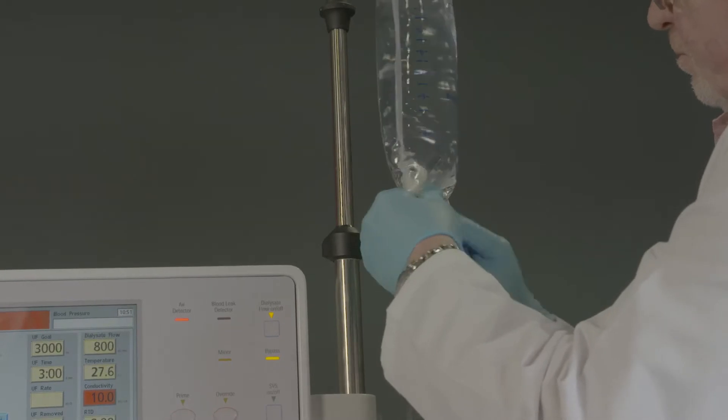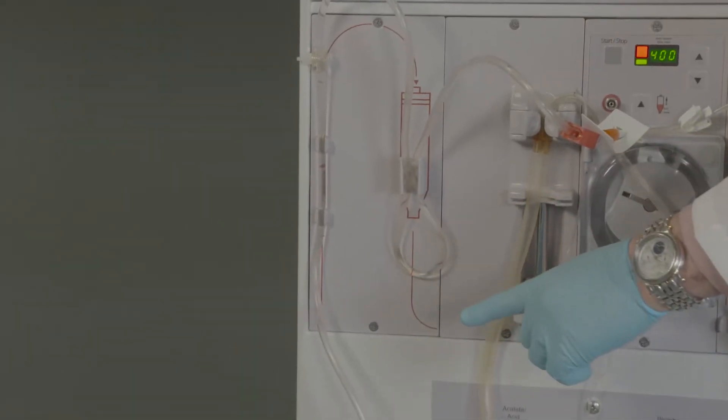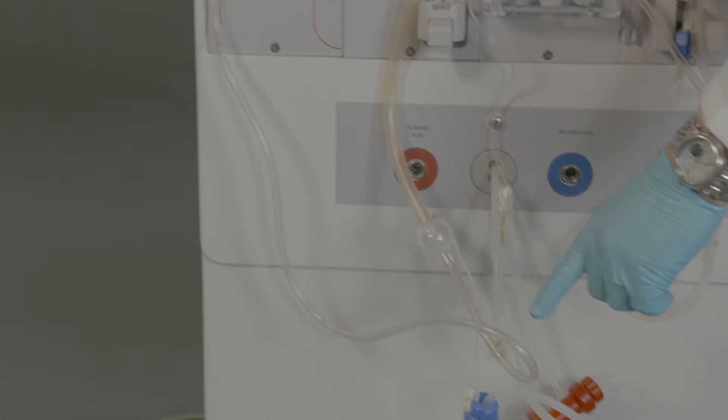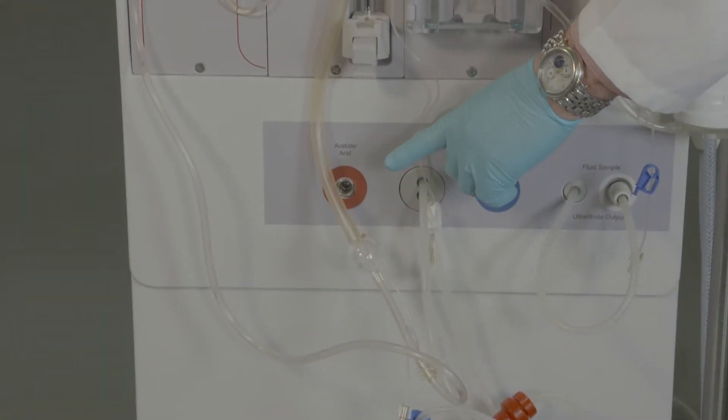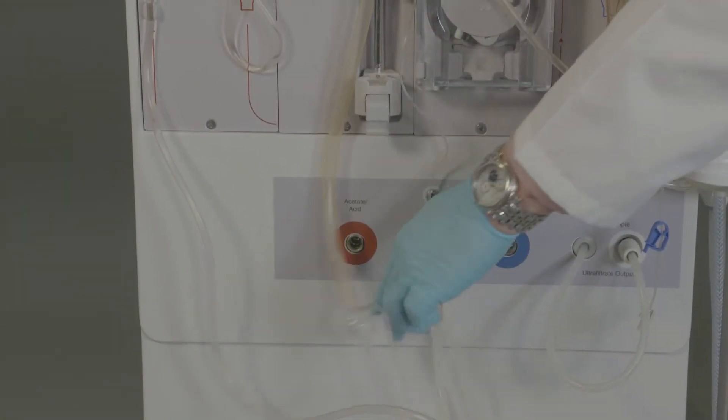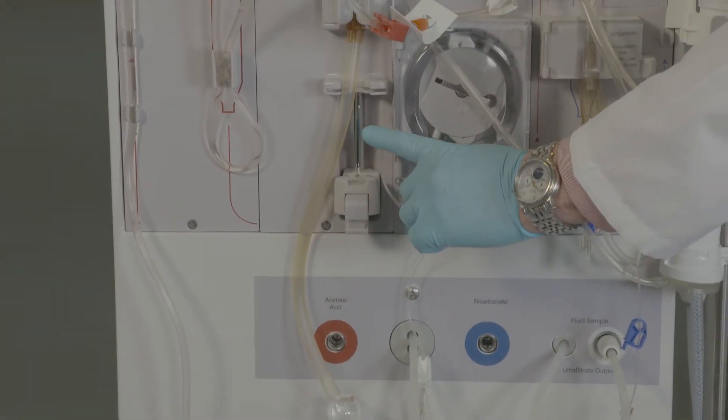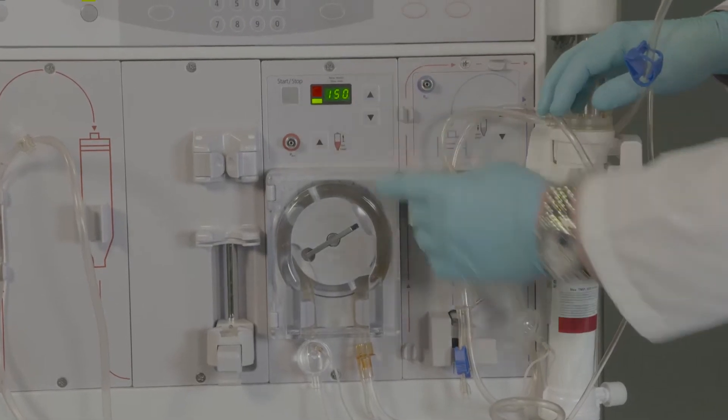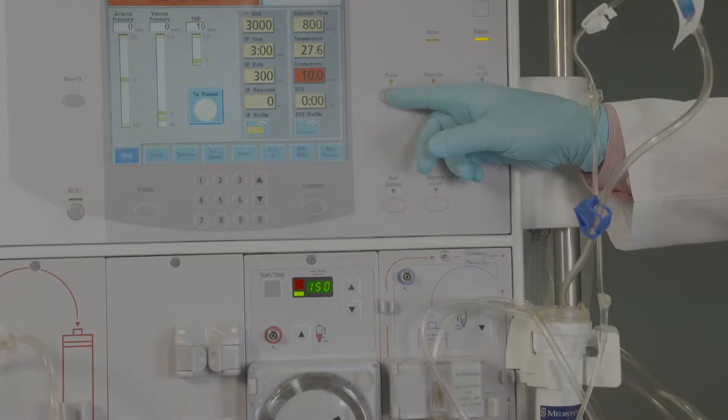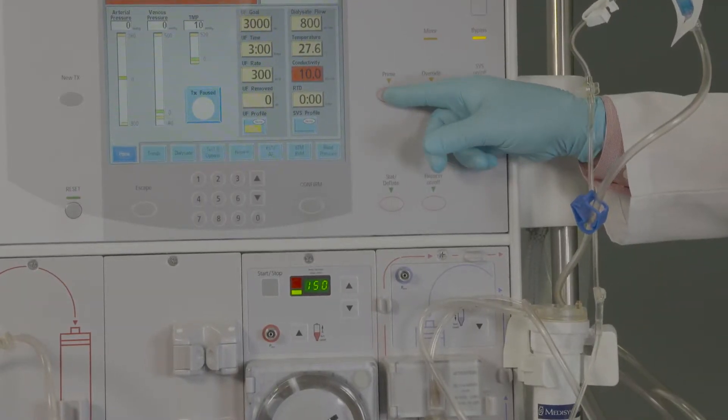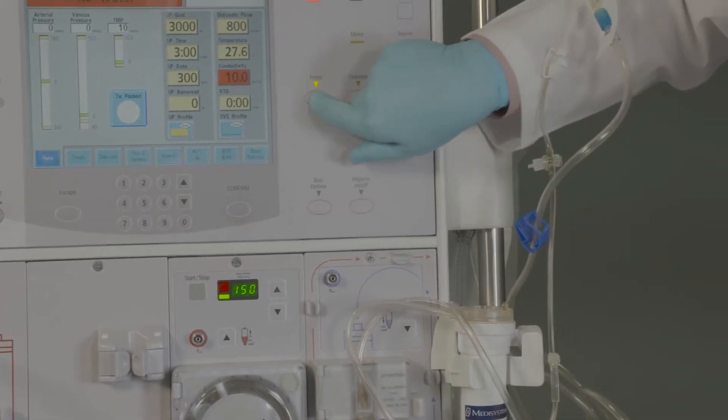Next is to perform a gravity prime before placing the tubing into the blood pump to ensure removal of all air. Saline must fully fill the arterial line, including the pump segment, up to the arterial dialyzer connection before inserting into the blood pump. We can then set the blood pump rate to between 150 and 200 milliliters per minute with a 300 milliliter prime amount volume.